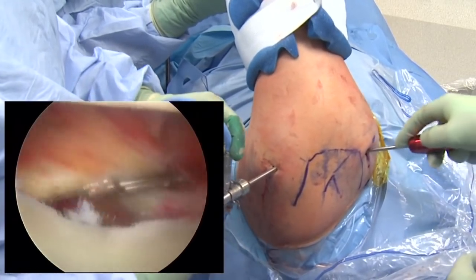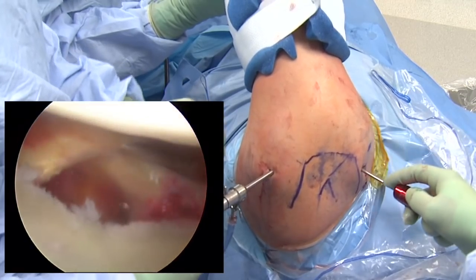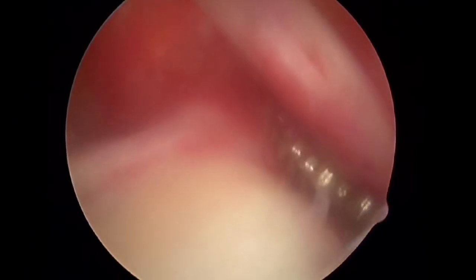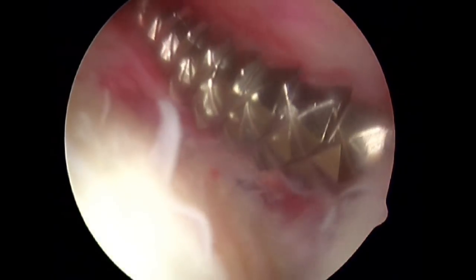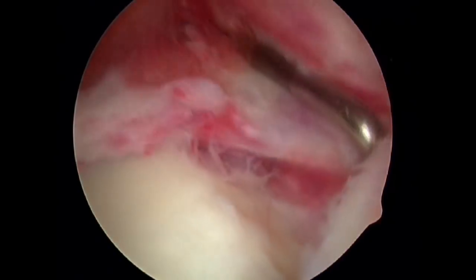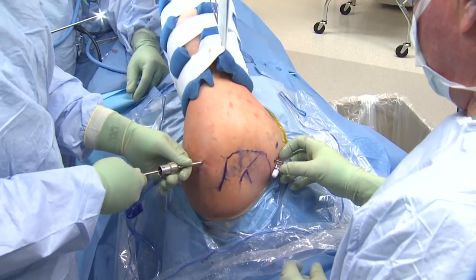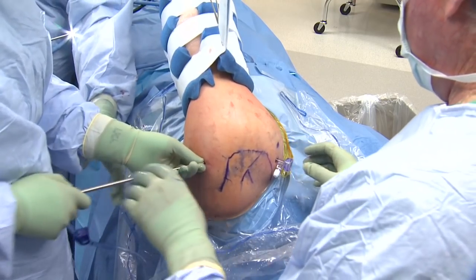We want to lift up the Bankart lesion so we can see the subscapularis belly, which we can see here. We're now ready to do our arthroscopic Bankart repair. We're going to demonstrate three different methods of suturing: one, a mattress; one, a single suture, which is a device-loaded technique so we can go through one cannula and tension down; and finally, my favorite — a simple suture passing technique.